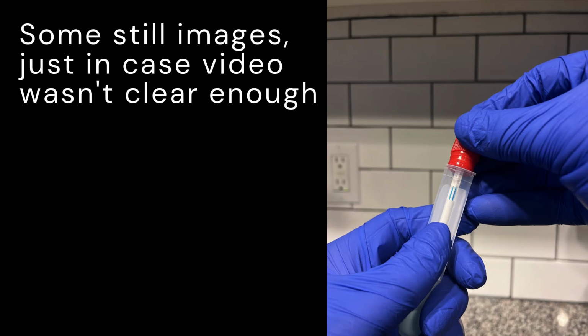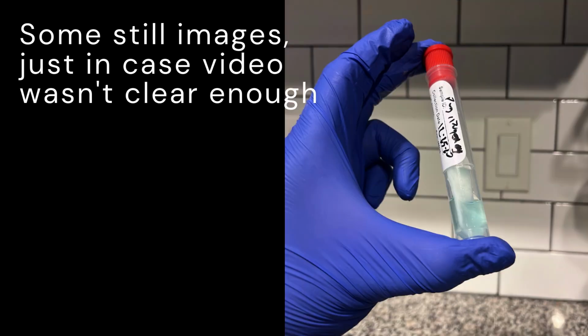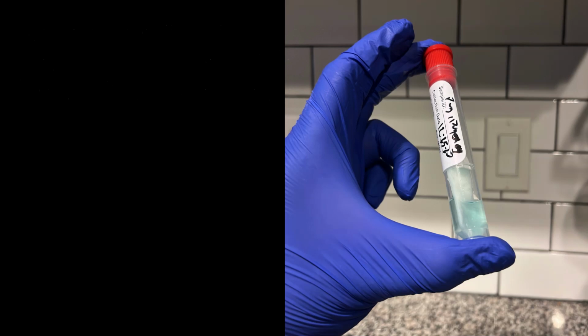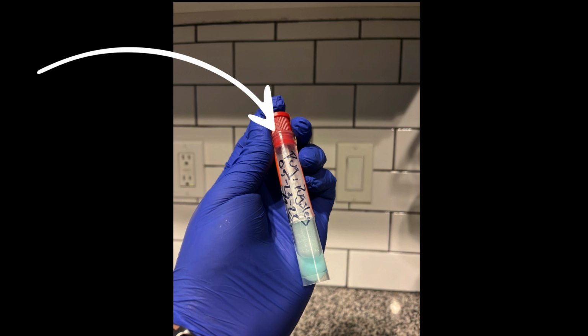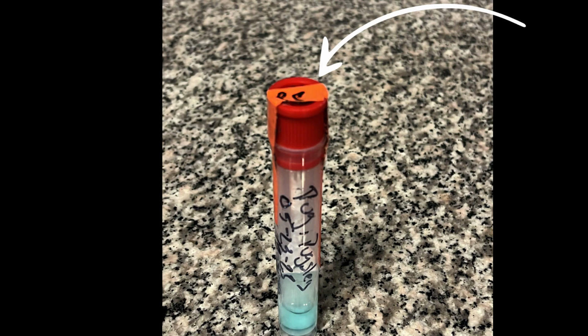Now you identify your transport tube. Make sure you write first name, last name, date of birth, date of collection on the tube itself and all your specimens. But do you notice how this is actually kind of small and sloppy, hard to read numbers? Do the lab team a big favor and write the numbers and characters nice and big and bold, so it makes it easier for them to read. Now remember to have your participant initial the top of the security seal tape on the cap.